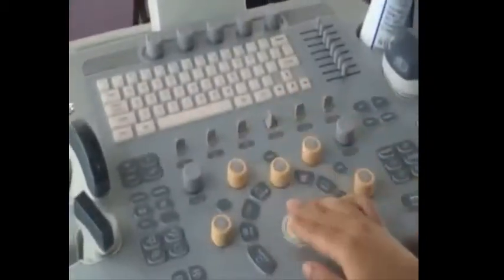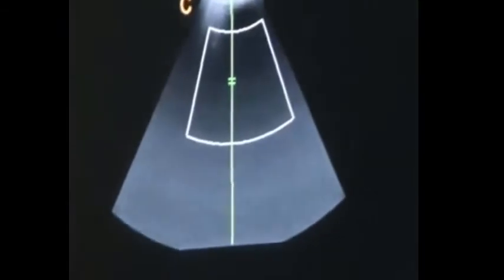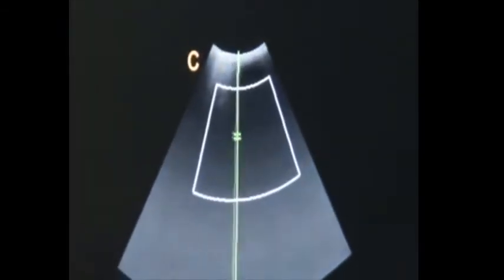Let's get into D mode. In Doppler mode, we should press Update to get the spectral image. Before we press this key, we should move the trackball to change the color gate position.